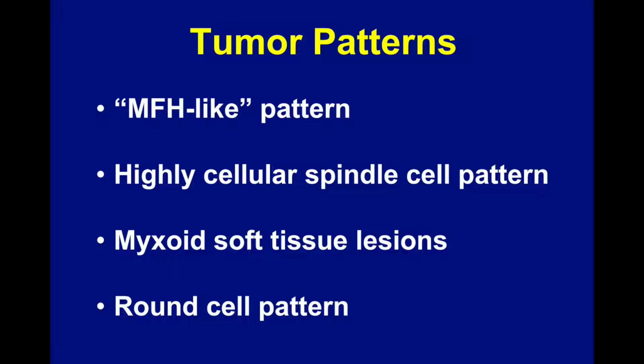The second pattern that I want to talk about is fairly common also in soft tissue, and that is a highly cellular spindle cell pattern. Third pattern, probably the most annoying of all these patterns, are myxoid soft tissue lesions.